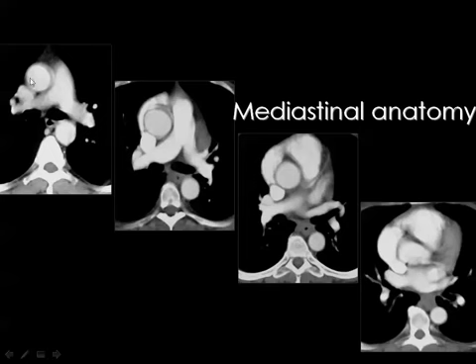Then this is the ascending aorta. It will enter here, and this is the left ventricle. And the left ventricle is adjacent to the right, and the right is adjacent to the atrium. Then the final chamber, or the remaining chamber, will be the left atrium. This is the left atrium, left ventricle, right ventricle, and right atrium, and this is of course the aortic root.